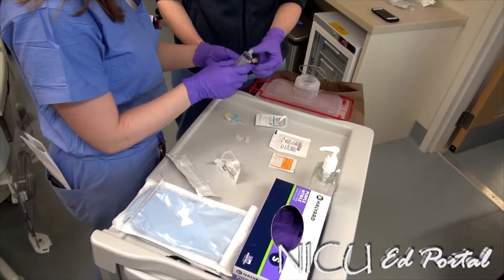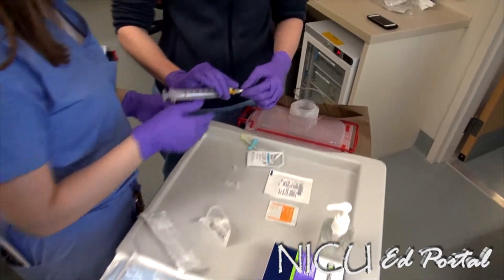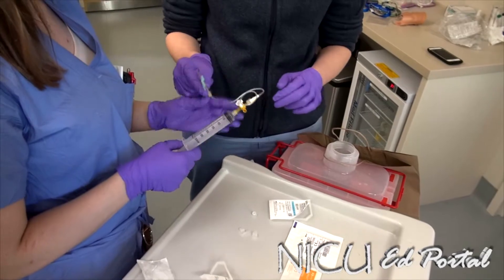You hook the stopcock up to one end. Now we have our whole system: the needle, stopcock, and syringe.